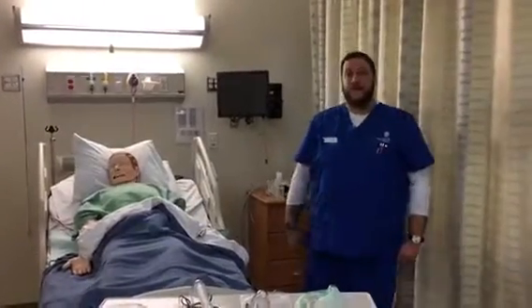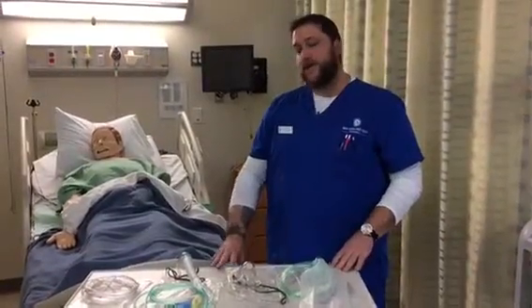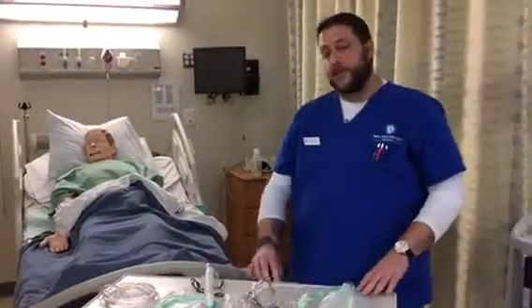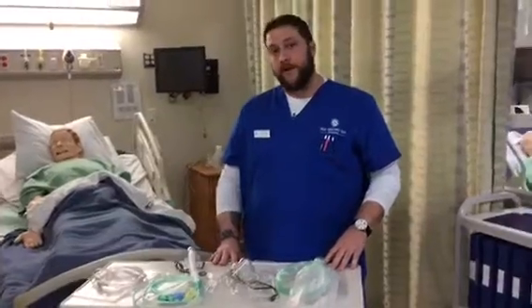My name is Troy Wall, and this is oxygen therapy and the closed chest drainage system. So first, we're going to do the oxygen. What we would do is check for the patient orders and see what is to be delivered.